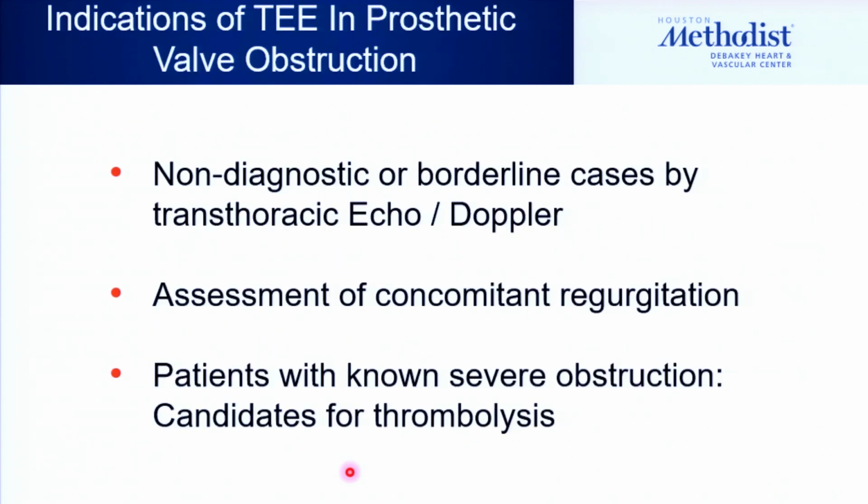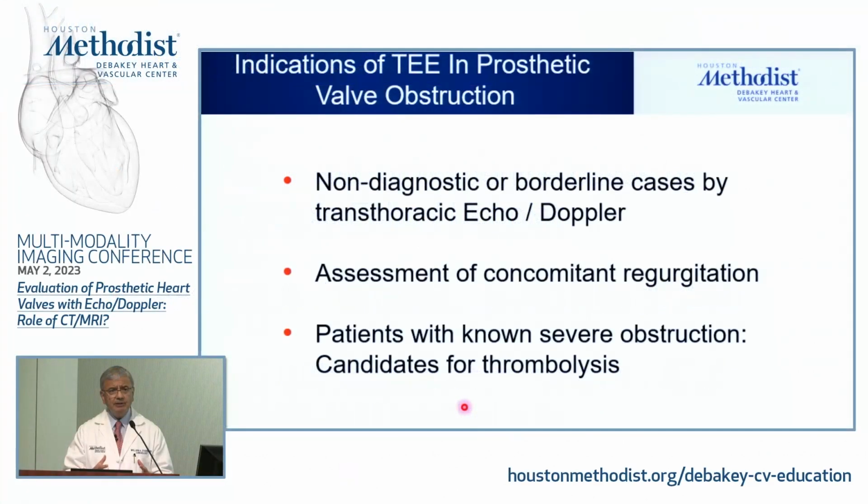So we haven't talked about TEE. And the reason we haven't talked about TEE is that all the hemodynamics you're looking at should be obtained from the surface echocardiogram. Actually, it gives you leeway, because some of these jets are in a funny position and you may not be able to align yourself in a transesophageal.